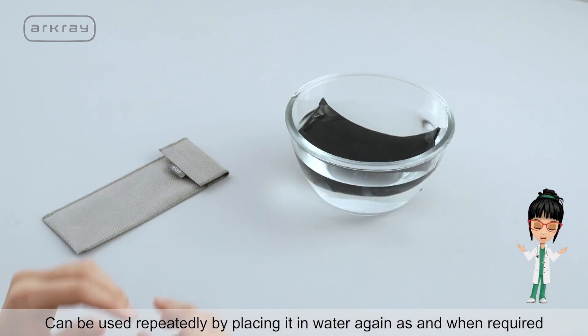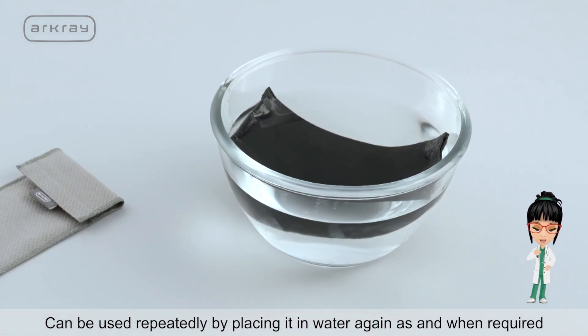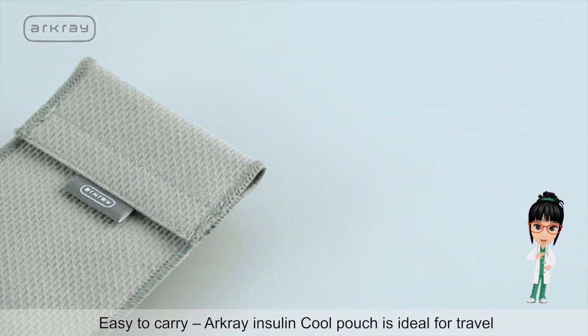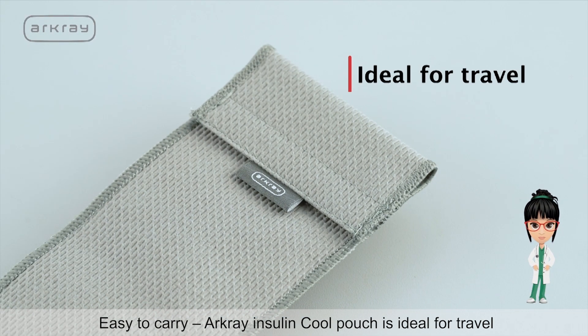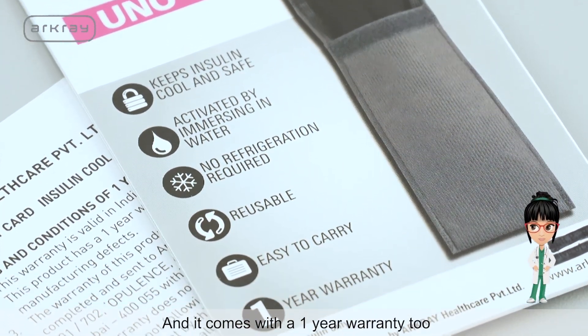It can be used repeatedly by placing it in water again as and when required. Easy to carry, ArcGrey Insulin Cool Pouch is ideal for travel and it comes with a 1-year warranty too.